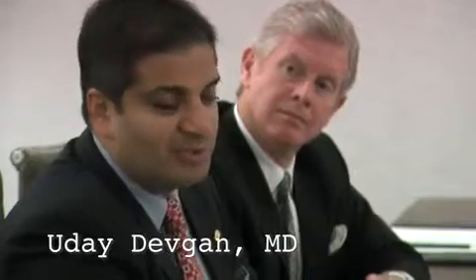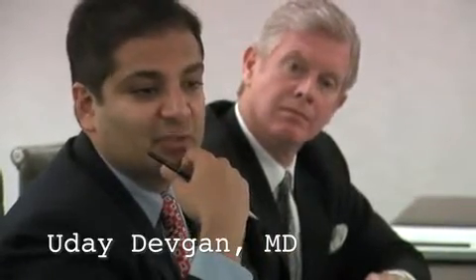One of the other important measurements for me is also the corneal thickness, which you're getting, the pachymetry. And this can clue me in first if something's wrong with the eye. Have I missed some Guttata? Is the cornea thicker than normal? Does the patient have some Fuchs that I've not seen? Is the cornea thinner than I expect? Have they had too much prior refractive surgery?